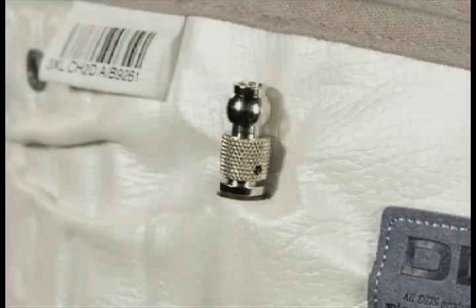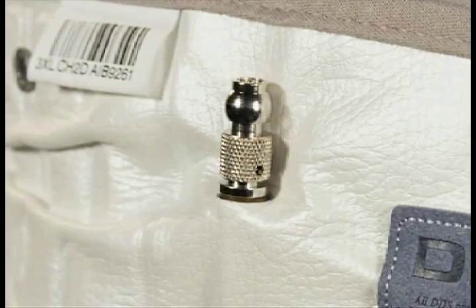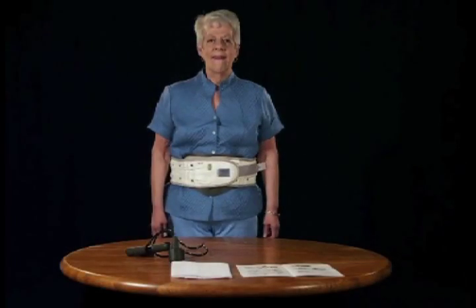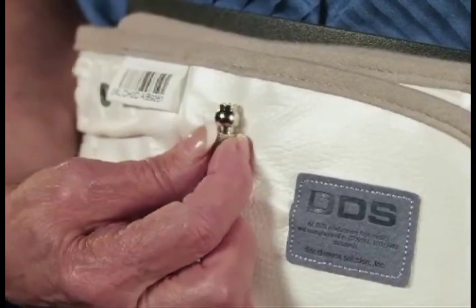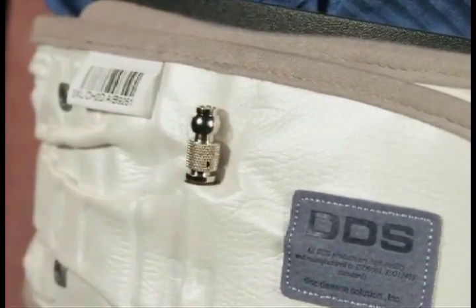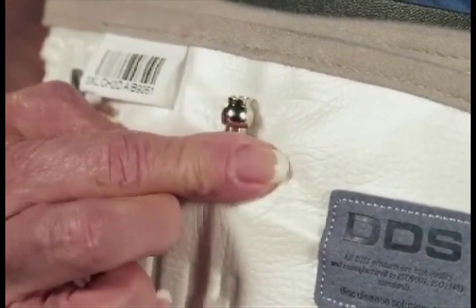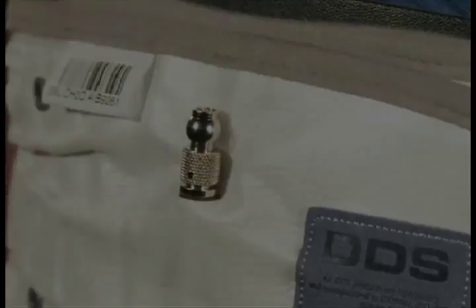Step 1. Grasp the air valve on the DDS Belt with your thumb and forefinger and deflate the device by turning the air valve in a counter-clockwise motion until you hear the belt begin to deflate. Upon complete deflation, turn the air valve clockwise until the valve is closed and is finger-tight as shown.